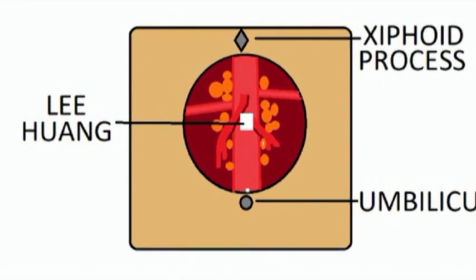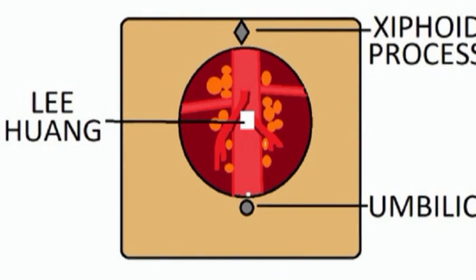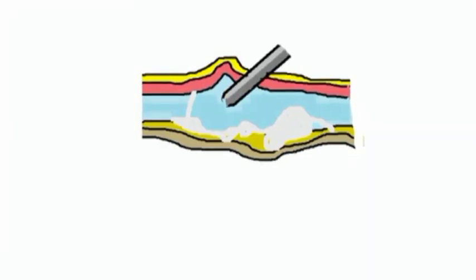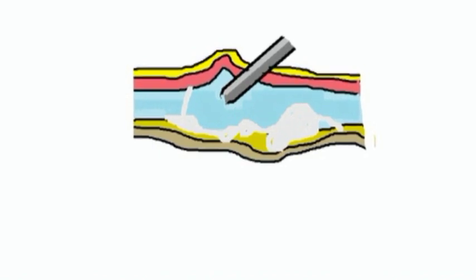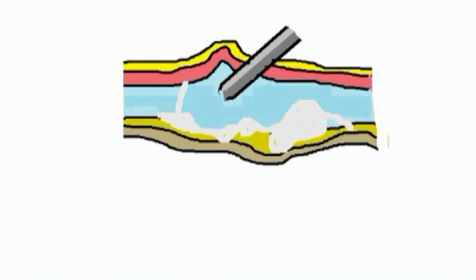Though it gave some help due to its higher location and central vision, this point is not very safe. In one study of 188 cases, 2 omental and 1 colon injury were reported. There is one other approach called the open Hasson technique. It is to remove adhesion. In this technique, a blunt trocar was introduced at umbilical level through a vertical incision and a pneumoperitoneum was created. But even this technique failed in type 2A adhesions.